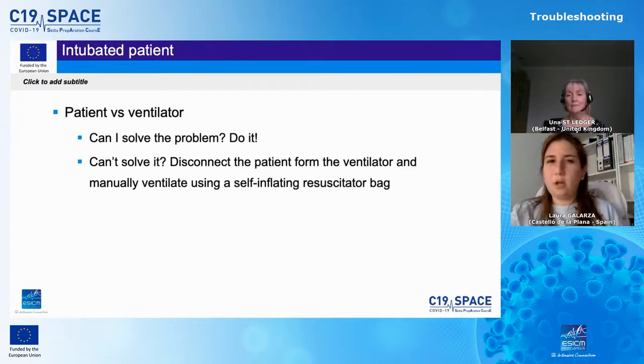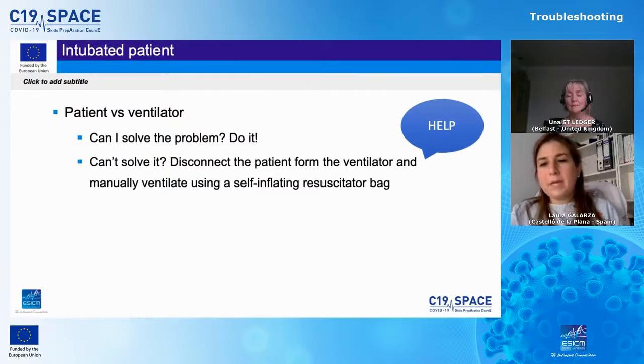Can I solve the problem? If yes, do it. If no, just call for help, disconnect the patient from the ventilator, and manually ventilate using a self-inflating resuscitator bag. This may not be allowed for non-ICU nurses in some countries or units. So you have to check in your unit if you are allowed to do it, or you should assist a senior nurse or a doctor in manually ventilating the patient.